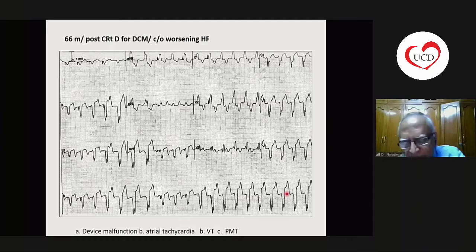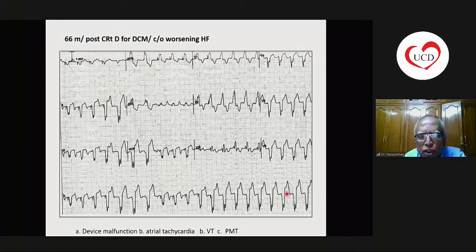So both atrial and ventricular arrhythmias, even when they are frequent and non-sustained, are a common cause of worsening heart failure in CRT patients. You should suspect this, especially when a person has initially improved and then comes back with this kind of a thing. Go back through the arrhythmia logs, the frequent PVCs, percentage of PVC, and percentage of biventricular pacing is less than, say, 85%. You should think that the PVC is preventing the CRT delivery, and you should get rid of this as a permanent solution.